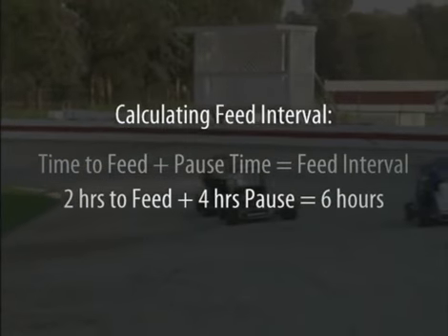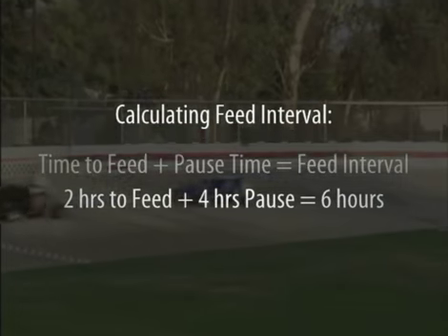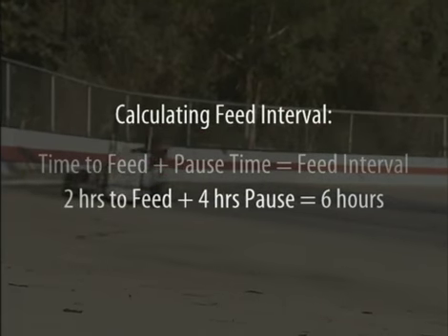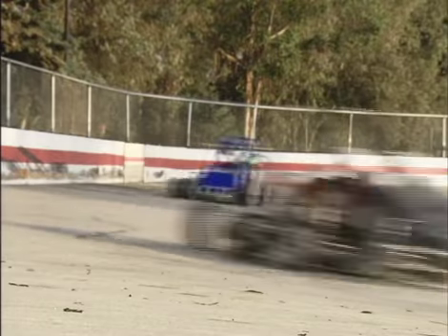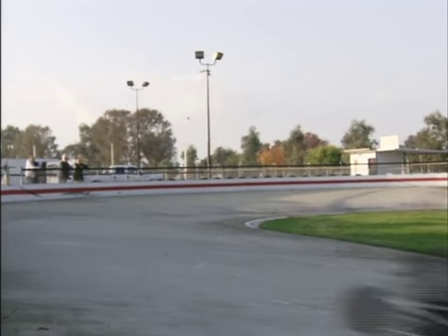When you enter the dose and the rate, the pump will calculate how long it will take to deliver the feeding. This is to prevent too little time from being programmed. In this example, 2 hours will be the shortest amount of time you can set as the interval feeding.